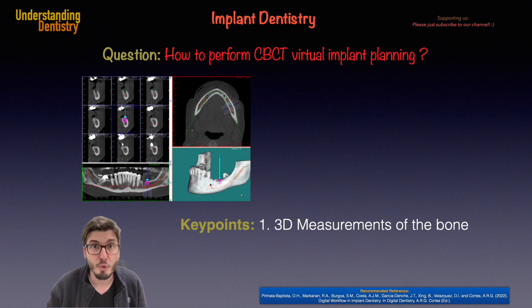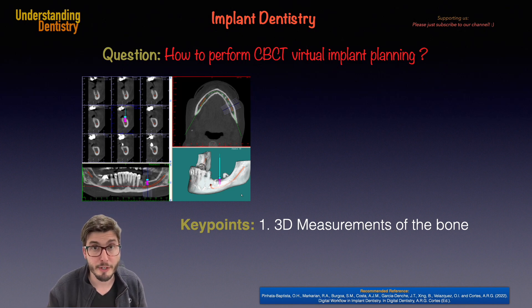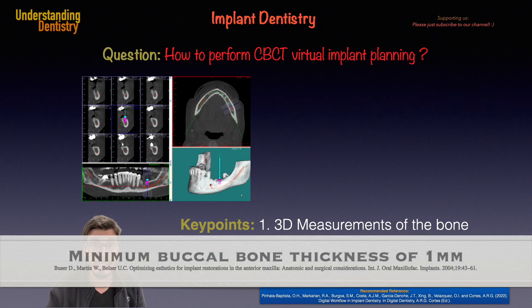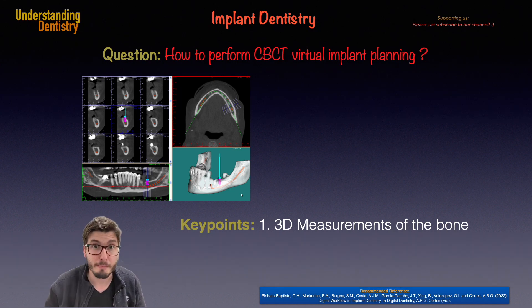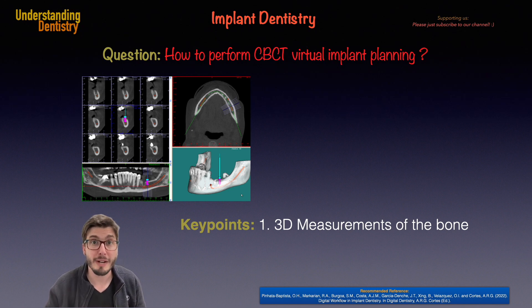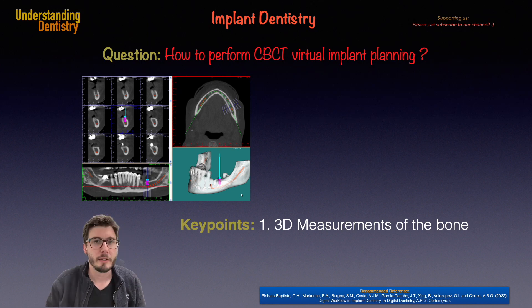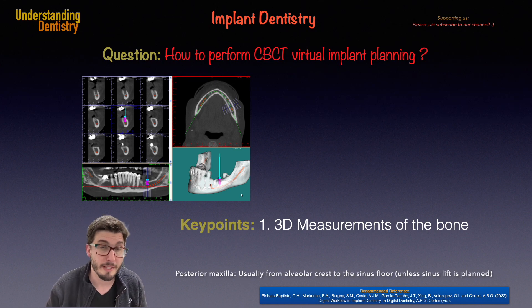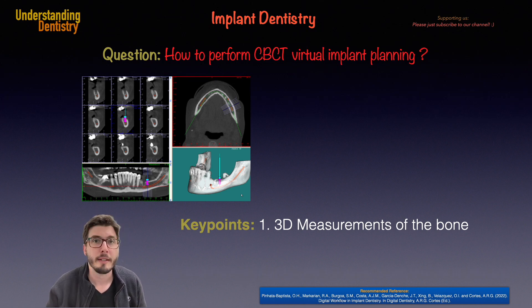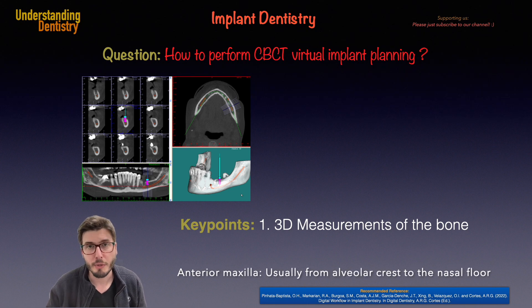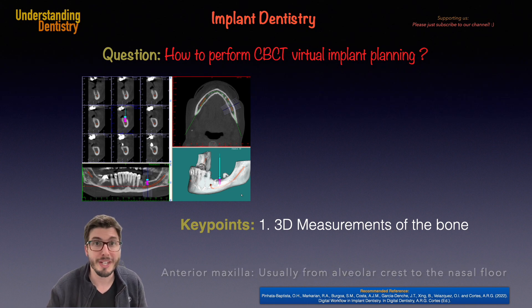These are true one-to-one measurements of the alveolar bone. It's very important to remember that for the bone width, we should leave at least 1mm buccal and 1mm lingual of remaining bone after we plan our implant. The bone height available can be measured from the alveolar crest to the next important anatomical structure to avoid. On the posterior maxilla, we measure from the alveolar crest to the sinus floor, and in the anterior maxilla, from the alveolar crest to the nasal floor.